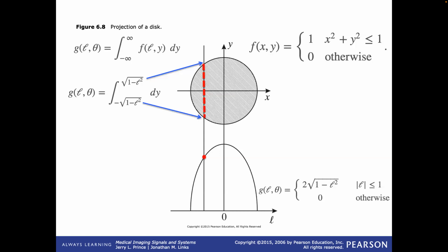If I have a detector along here and I know precisely the separation of my detector elements, then once I know this analytical function, I can compute the analytical intensity measured by that detector for this object. This is all before noise and things like that.